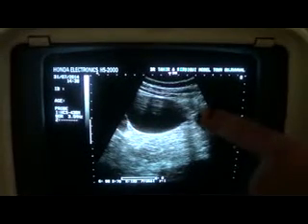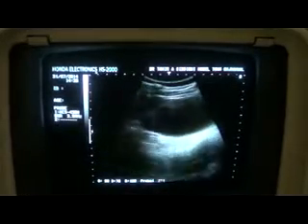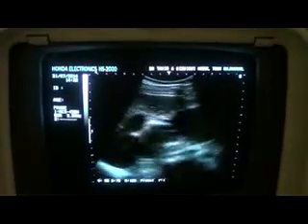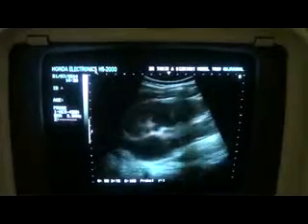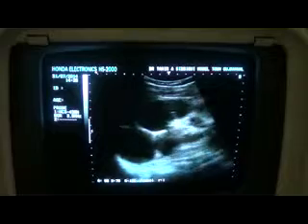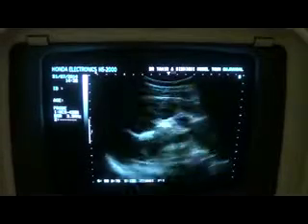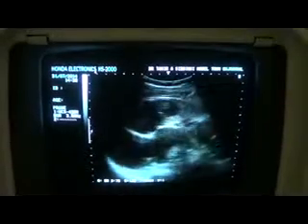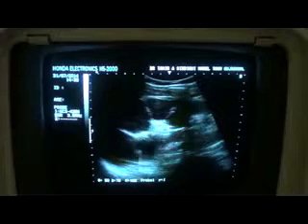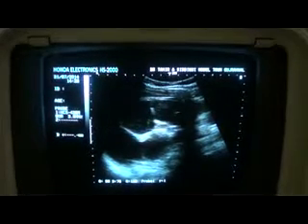And this is the basic cause of the remaining pathologies that we are seeing in the form of all the calyces being dilated massively. That's leading to total thinning of the parenchyma at all regions, and along with it we see the dipping sign.